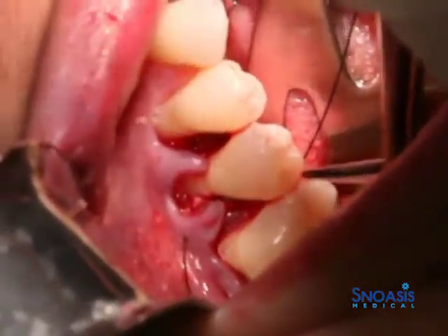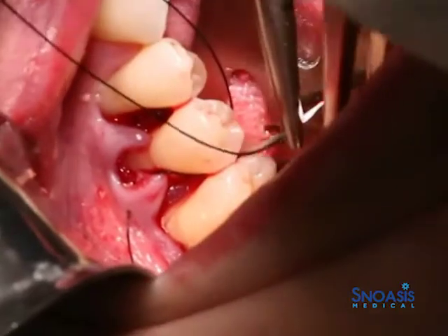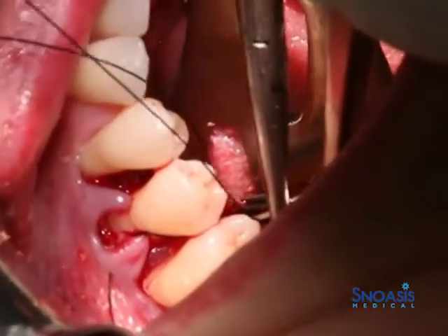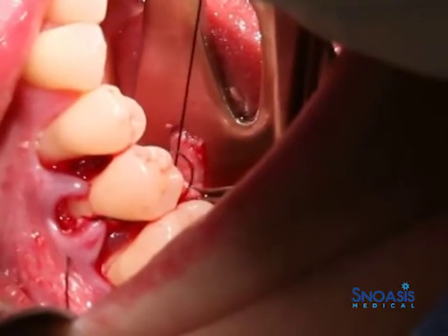Use some cotton forceps to manipulate your flap. And the nice thing with the BioXclude is if you do have any exposure during healing, like in the col area, it's okay because this can become exposed and heal just fine.